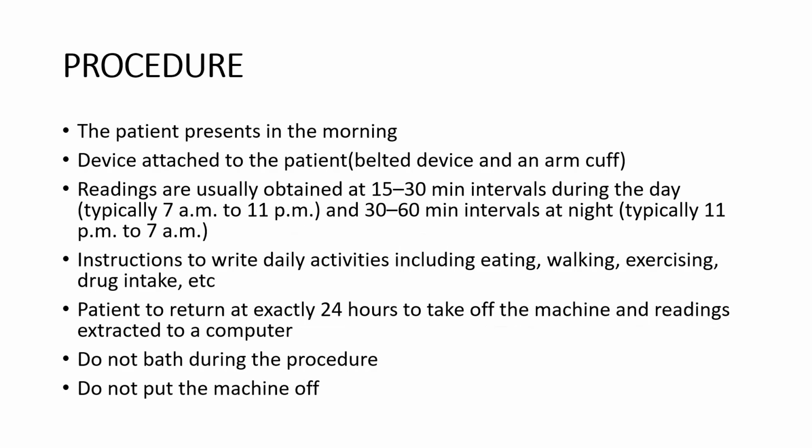Readings are obtained at 15 to 30 minute intervals during the day, typically 7 a.m. to 11 p.m., and 30 to 60 minute intervals at night, typically 11 p.m. to 7 a.m. The patient is instructed to write down daily activities, including eating, walking, exercise, drug intake, etc. Patients are required to return at exactly 24 hours to have the machine taken off and readings extracted to a computer. They are not expected to take off the machine so that adequate information will be obtained.